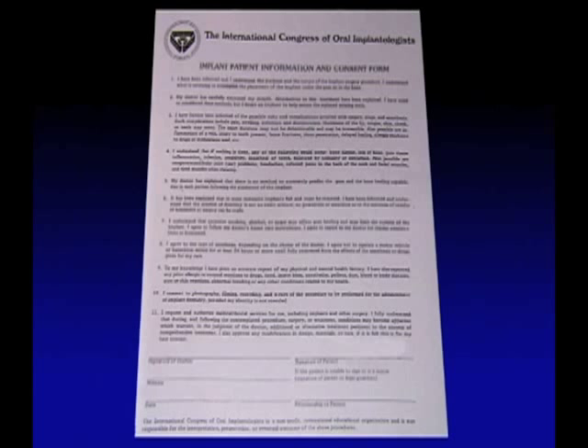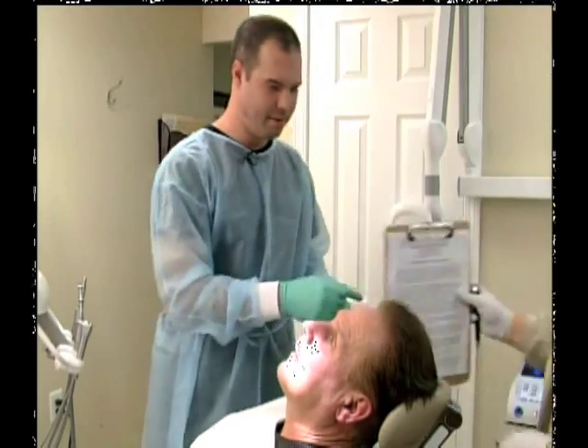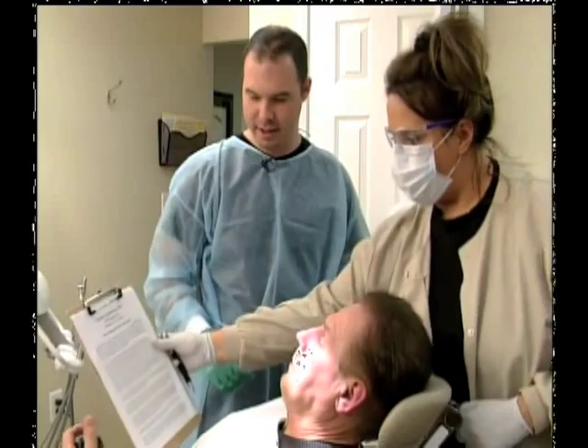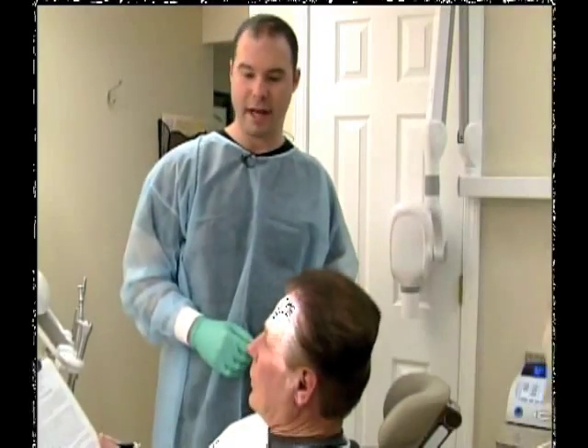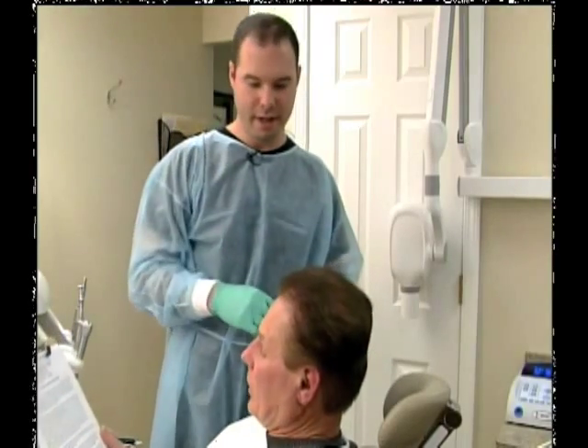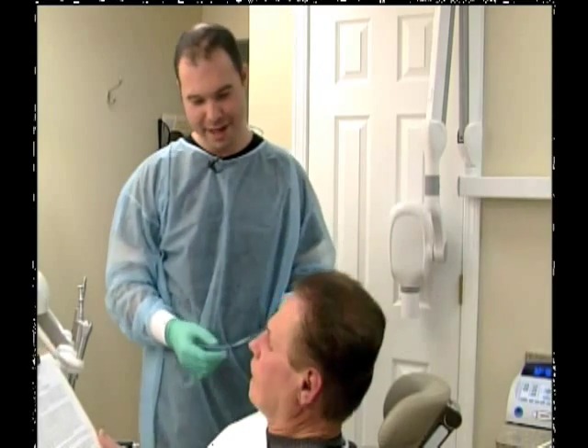So the first thing that we always do is have our patient review our consent form. I have one custom made that follows our state laws and guidelines, as well as informs the patient about everything from typical complications. My patients always know that when they're with me, complications can arise in any procedure, but they typically understand that as long as you come back and see me, we'll take care of everything.